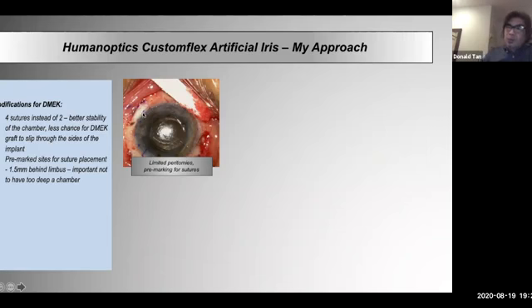The reason is that we're going to do DMEK in these cases. And so we want perhaps a slightly shallower chamber rather than a deeper chamber. So when you place this artificial iris, where the peripheral iris was, you could either place it around the same plane, you can place it slightly anterior, or sometimes you can leave some iris behind as a target and place the artificial iris behind the natural iris. And I would not recommend that, because the chamber becomes very deep. So it's important to get some idea of how deep you want to place this iris to make your DMEK easier.